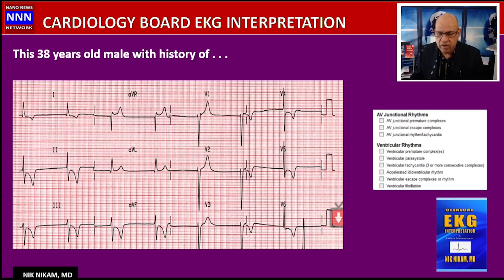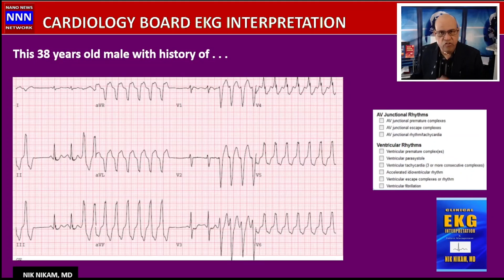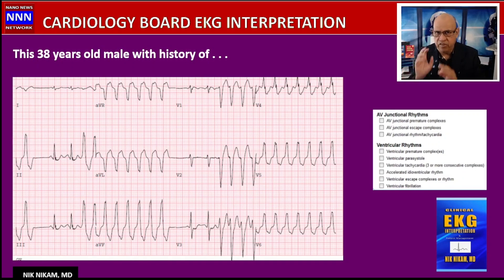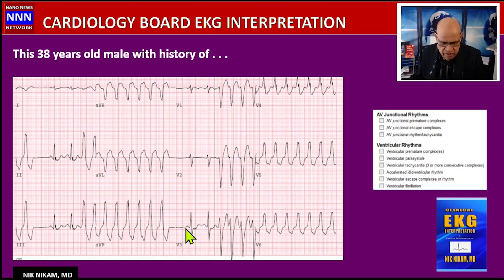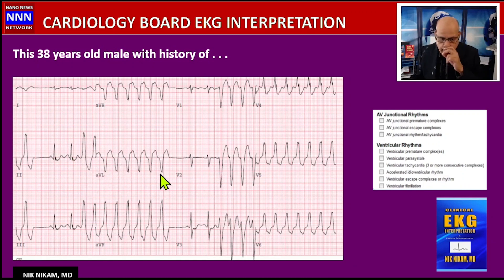For ventricular arrhythmias: premature ventricular beats, couplets, triplets, short bursts of ventricular tachycardia. In a patient with atrial fibrillation, be aware of Ashman phenomenon. On the example shown, we see a P wave, then a burst of what looks like ventricular tachycardia — a sinus rhythm with a PVC precipitating VT. These are things we should be able to identify.